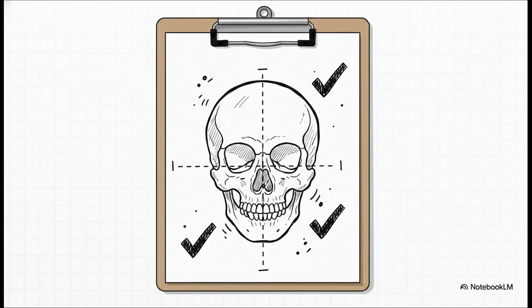But how do we actually prove there's no rotation? Look at the second point. You must see equal distances from the lateral borders of the skull to the lateral margins of the foramen magnum on both sides. Third, we're looking for perfectly symmetric petrous pyramids. And lastly, to confirm that our 25 degrees cephalad angle was spot on, we must see the dorsum sellae and the posterior clinoid processes projected squarely within the foramen magnum. If you've got all of these, congratulations, you've got a successful Haas projection.